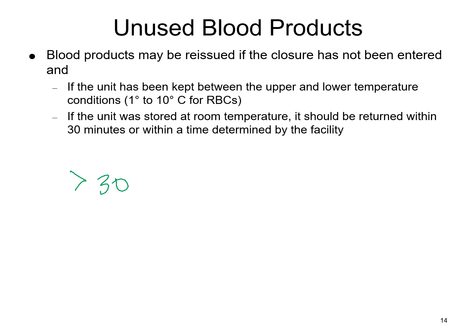Let's just say that the nurse gets back to the floor, and she or he had another patient that coded, so she laid the unit at the front desk with the secretary, ran the code, and then comes back to try to start that unit of blood for that patient that she came down and requested on, and realized that, hey, it's like 45 minutes later because I've been dealing with this, and calls the blood bank and says, I couldn't issue this unit of blood and it's been more than 30 minutes. What do you need me to do?